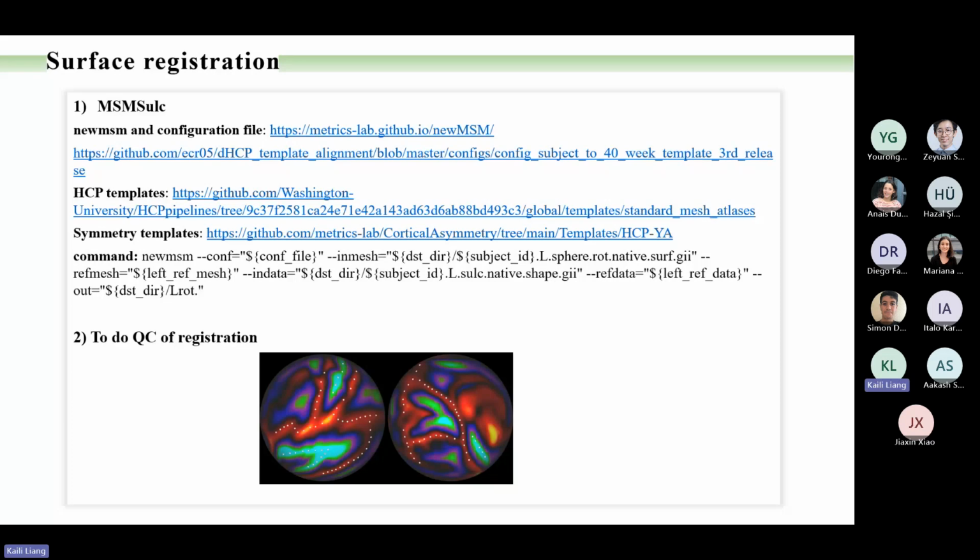Yeah, and then if you're doing... Are we talking about the childhood data? Yeah. And you're registering them to the HCP symmetric template? Yeah, yeah. Okay, not the dHCP, because it's symmetric templates for children, those symmetric templates with the dHCP, right? Oh, no. Young, this is adults. Just a configuration file. The configuration file is the same, but the templates are different. Oh, sorry, I'm right, yeah. Sorry.